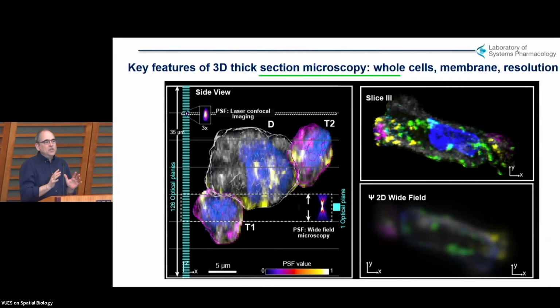The reason for that is we think that even if it's available only in somewhat limited form, high resolution three-dimensional data is going to be the gold standard we're going to use for cell segmentation, tissue type identification, et cetera. And what we have currently in 5-micron data is sort of a tin standard. So, we tend to have in these problems bronze standards, and you say, here's the human annotated standard, how good is my machine learning algorithm? But if the human standard is already really problematic, then you have a real difficulty getting algorithmic convergence.